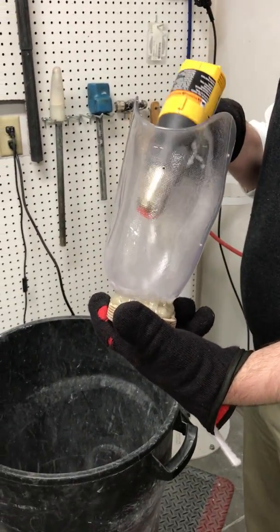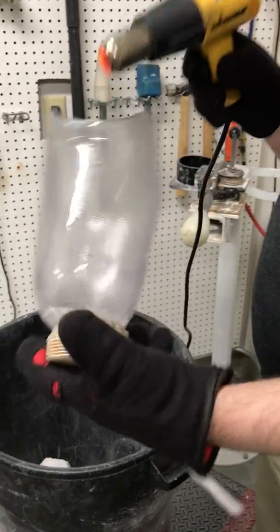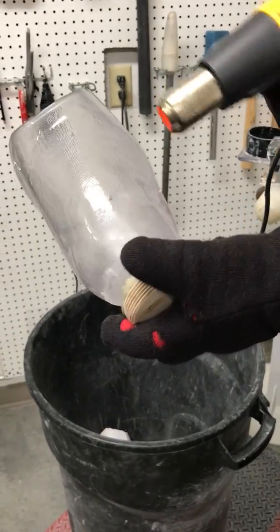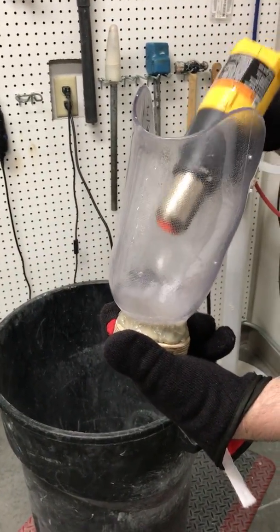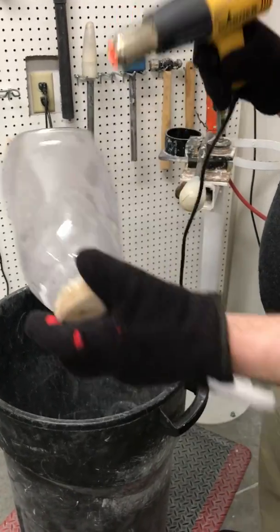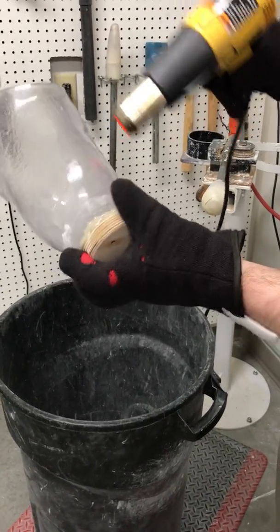This video shows how to use the tools we have to help mold Vivak. You get your Vivak nice and hot to the thermoforming temperature, ready to be molded. In this case we're heating up the anterior distal tibia of a BK socket.